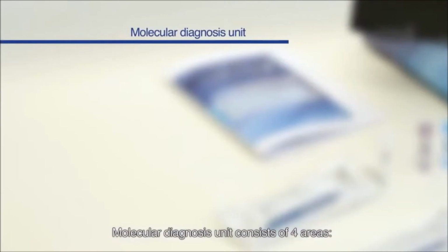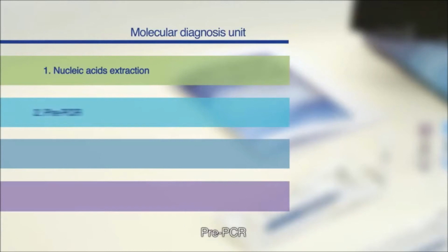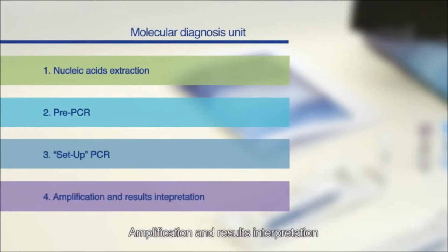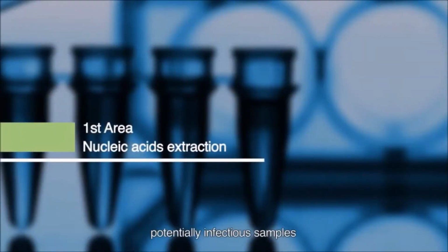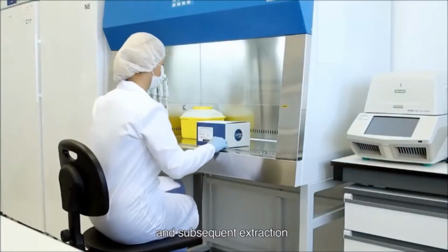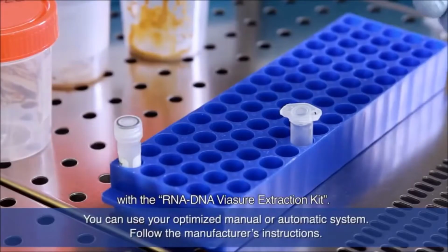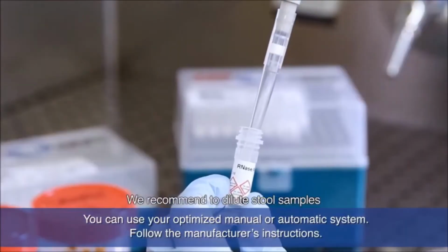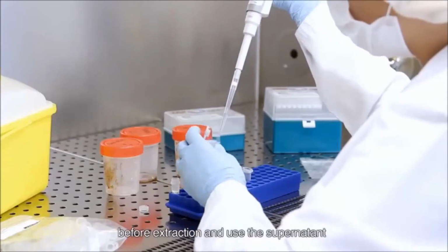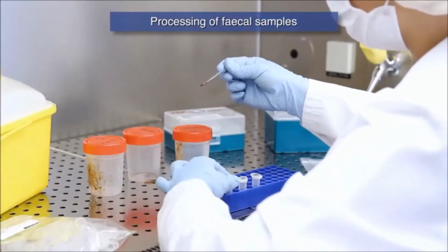The molecular diagnosis unit consists of 4 areas: nucleic acids extraction, pre-PCR setup, PCR amplification and results interpretation. The first area aims to process potentially infectious samples and subsequent extraction and purification of nucleic acids with the RNA-DNA ViaSure extraction kit. We recommend to dilute stool samples before extraction and use the supernatant to perform DNA-RNA extraction.